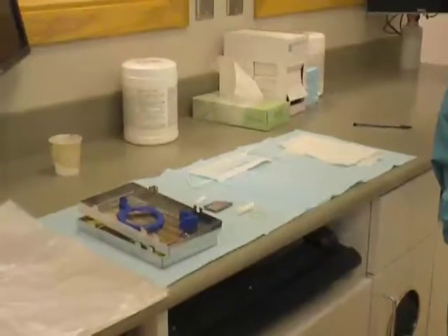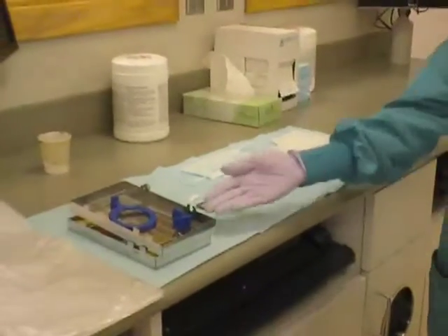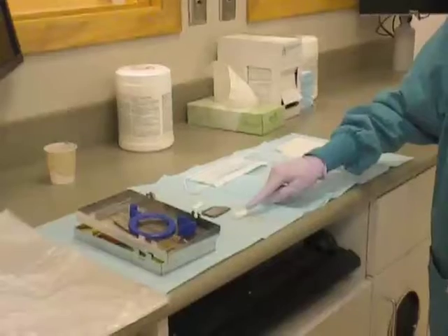Unit Setup. Seat the patient in a blue chair and collect the following items: a radiology cassette with XCP instruments, cotton rolls, and rubber bands.